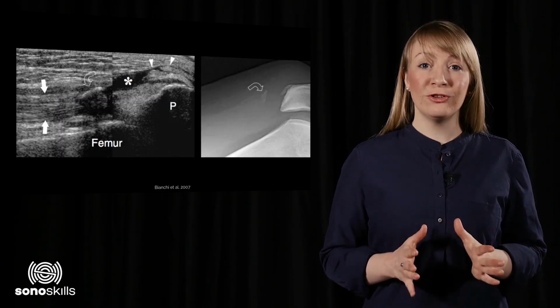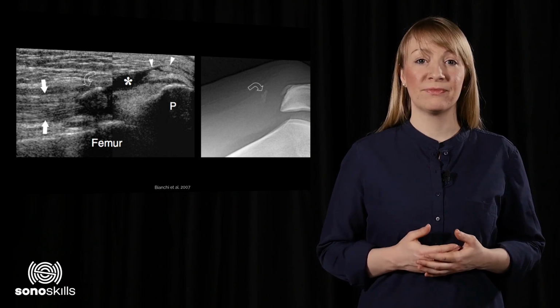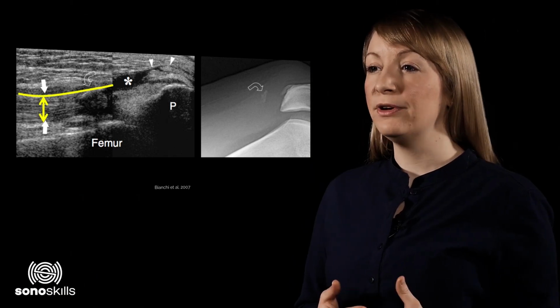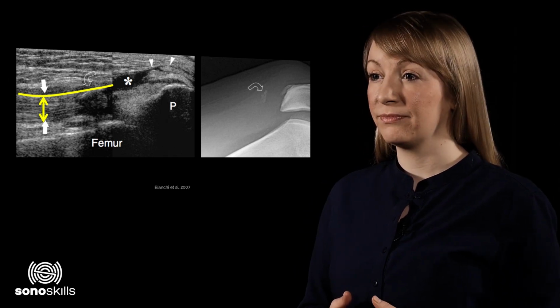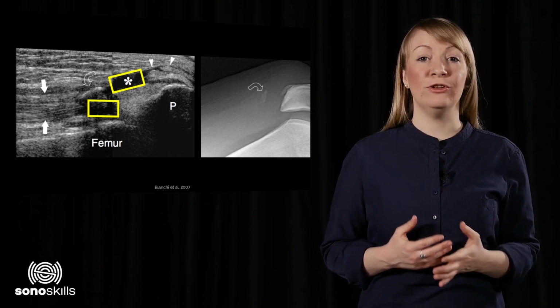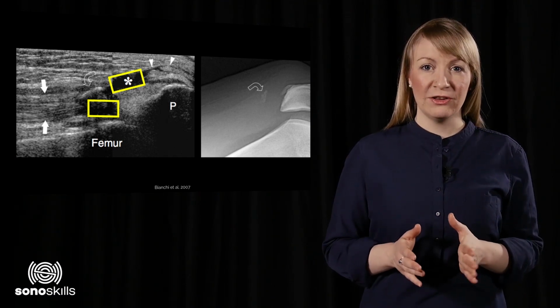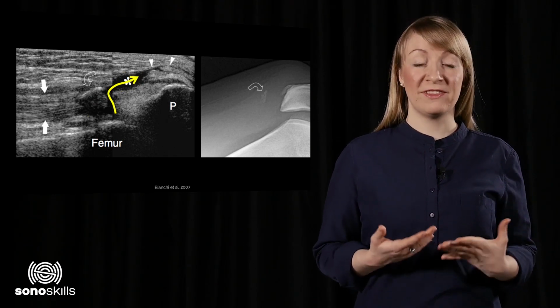This is a longitudinal scan of the quadriceps tendon insertion to the patella. The quadriceps tendon shows a change in shape due to a concavity of the quadriceps epimysium. The suprapatellar region shows a change in echogenicity. Please note the anechoic parts, which seem to be fluid arising from the suprapatellar recess.